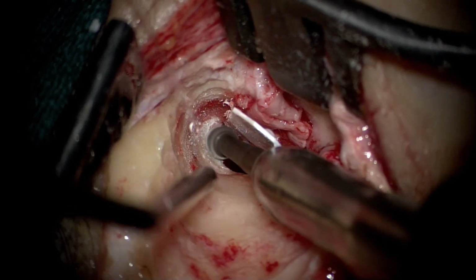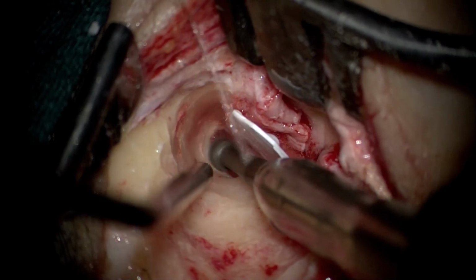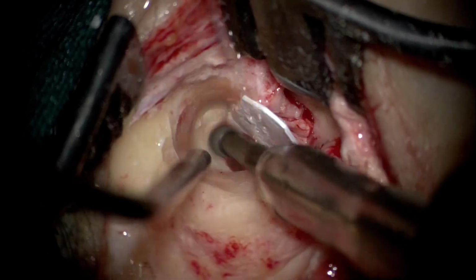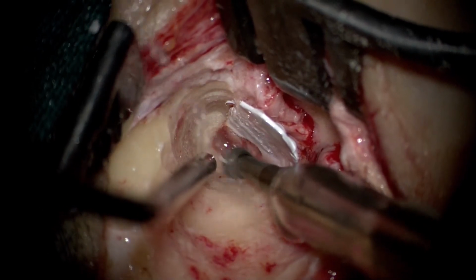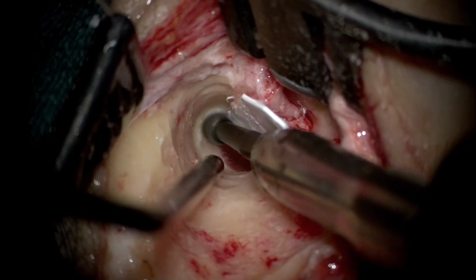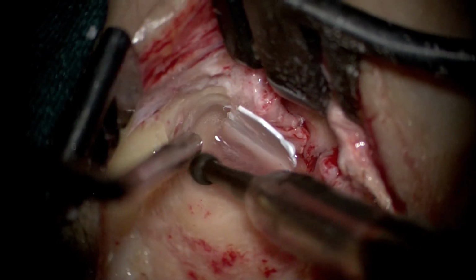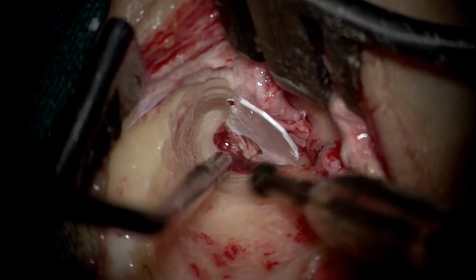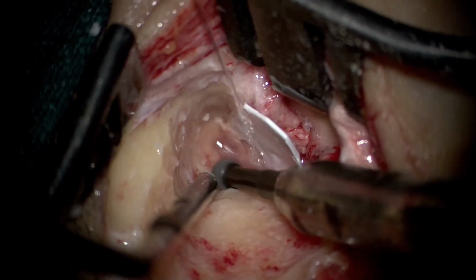As you see here now, we are drilling the attic shelf, the scutum bone, which is often eroded in these patients. It is important and imperative to use the right sized burr. A very large size or a very small sized burr, both would be non-beneficial, in fact harmful in these patients. A small sized burr can slip inside or pierce the tegmen or the ossicles, and too large a sized burr, especially a cutting burr, will cause collateral damage on the blind side, which is not visible while drilling.